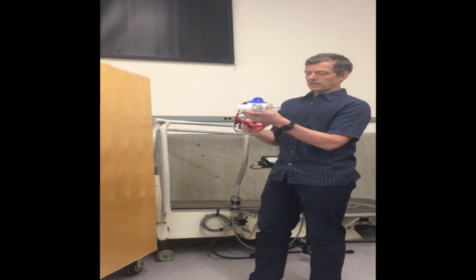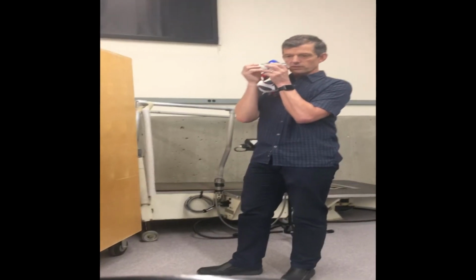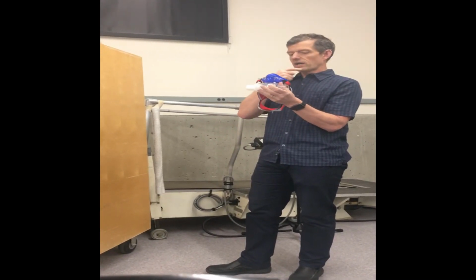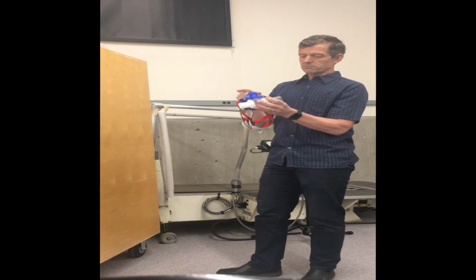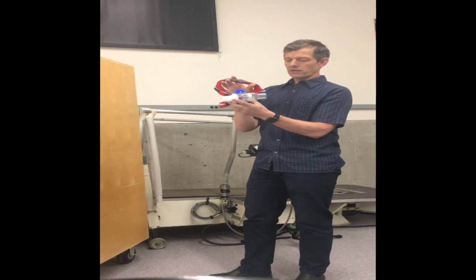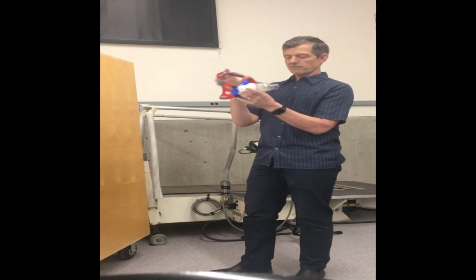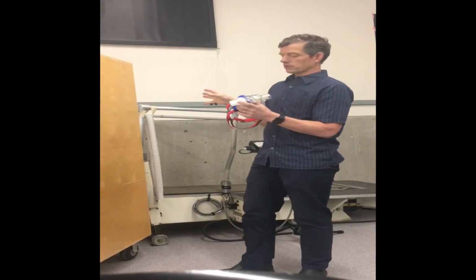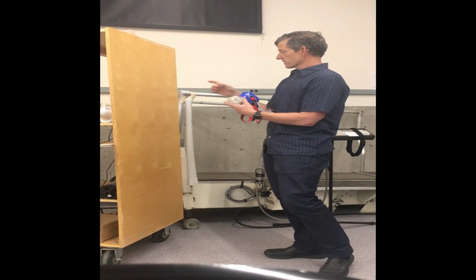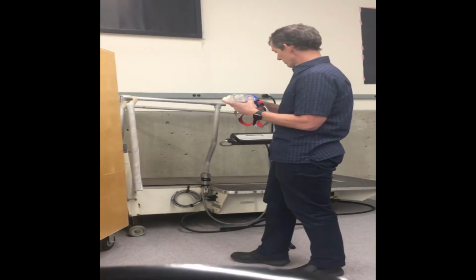The way this harness works is you can unclip one side, and then we'll clip it onto the subject's head by clipping it this way, clipping it in the other hole, and then if we need to adjust it, we can. I always have the subject do a positive pressure test where they put this on their mouth and hold these two ends and blow out, just to make sure there's no air leaking. So again, a big part of this is making sure that no air is leaking. The subject's going to put the mask on before they get on the treadmill. We're going to make sure that everything is adjusted correctly. Then they're going to get on the treadmill, and we are going to hook the hose up from the clear side into the mixing chamber when we start the protocol.